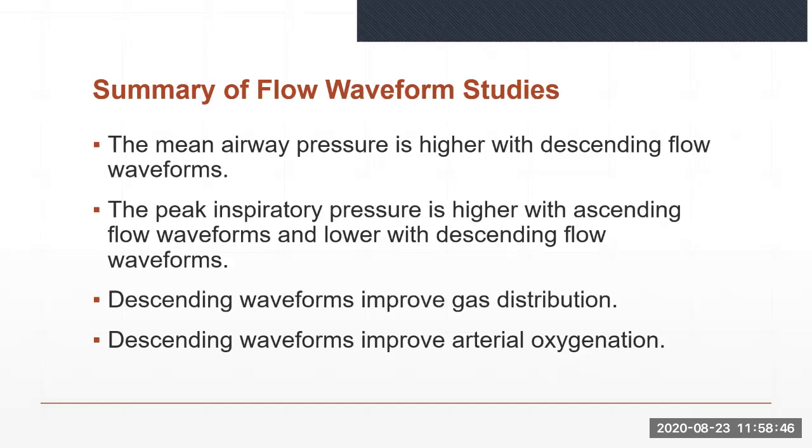It is important to remember that in situations where plateau pressure is critical, changing to a descending ramp to reduce peak pressures may increase the mean airway pressure. The clinician must decide whether mean airway pressure is more important for the patient.